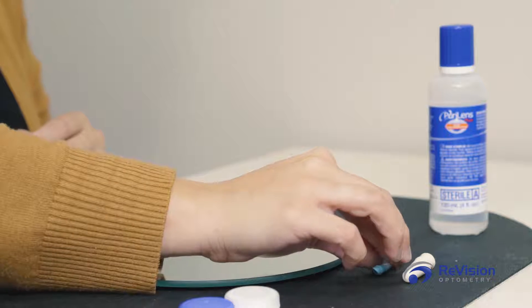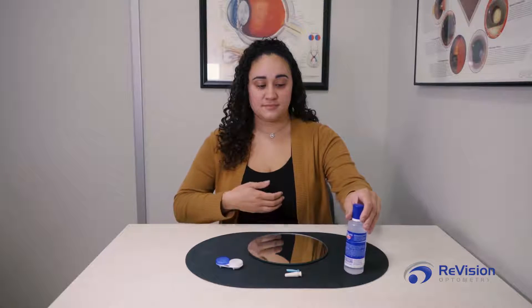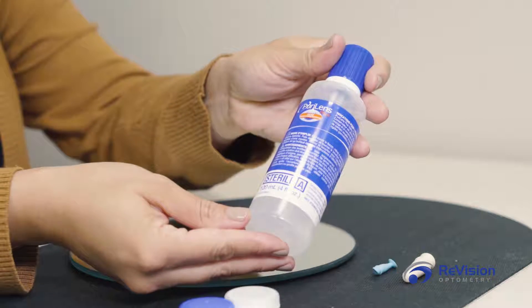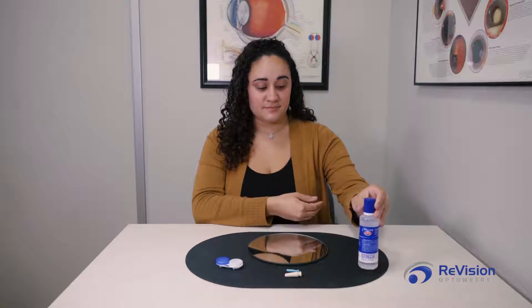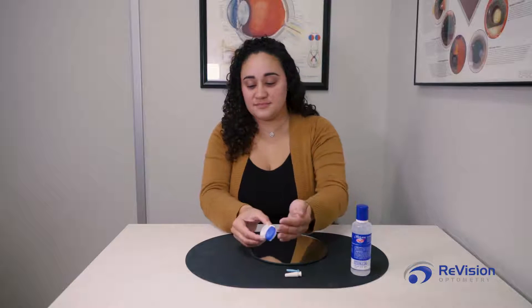Preservative-free saline solution, or non-preserved saline, is also important to use for rinsing and applying scleral lenses. Redness and irritation of the eye can occur with a preservative saline solution. Lastly, you'll need your scleral contact lenses.